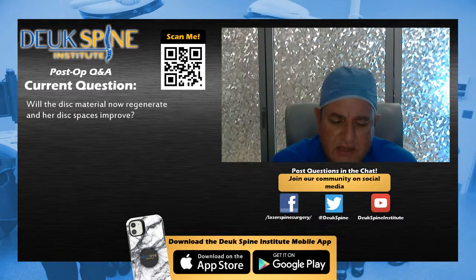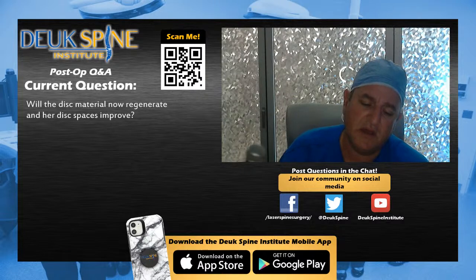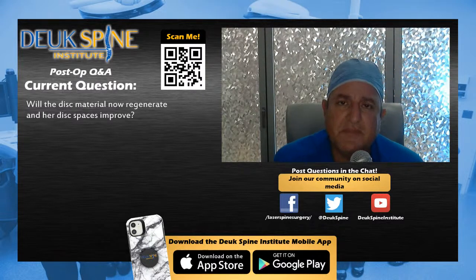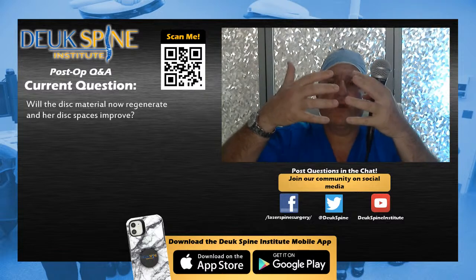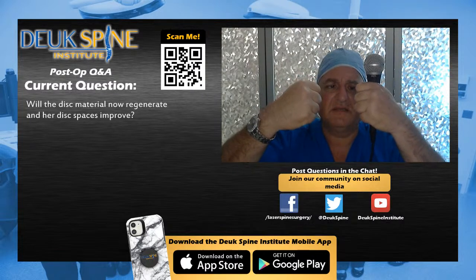So that said, no, today I didn't even close up the annular tear. We never do. All I do is clean up the annular tear. The tear is still there, and it's actually a little bit bigger when I'm done debriding it. But the key difference is that the tear can now heal itself. Whereas before it was kind of ratty like this, I cleaned up these edges. Now it looks like this.